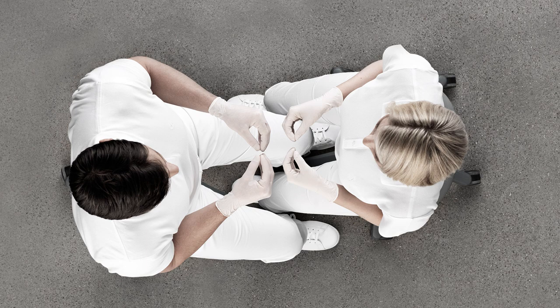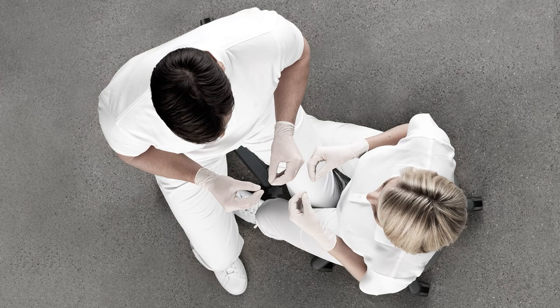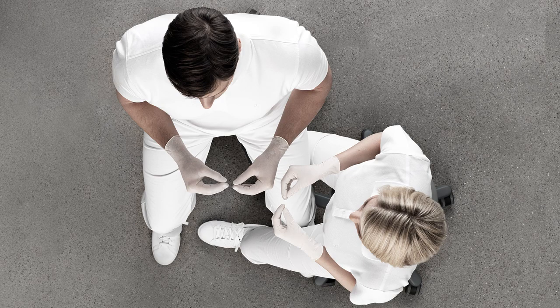With the IXO patient chair you can work in positions from 9 through 12 o'clock with lots of space also for your chair side assistant. When working with a supine patient, these positions provide you with the best possible view of each tooth surface without bending or straining the neck, spine, or upper body.